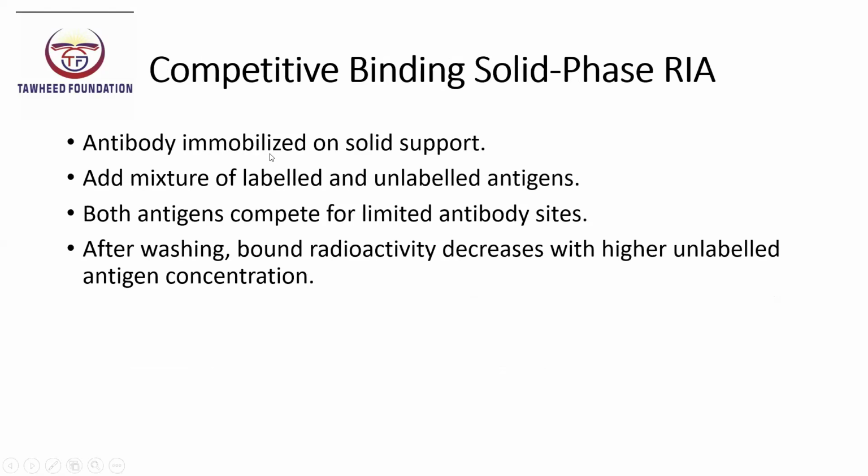Next is competitive binding solid phase RIA. The competitive binding solid phase RIA is a refined version of the classical assay. In this method, the antibody is immobilized on a solid support.